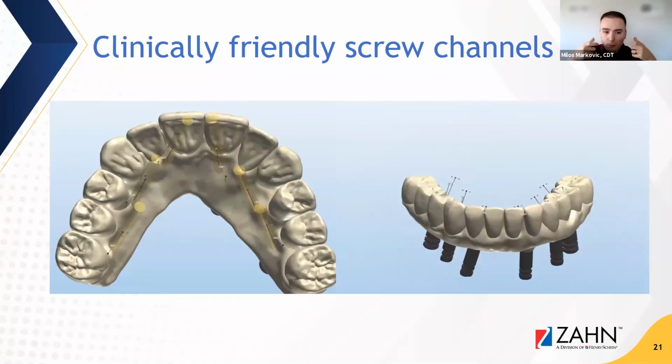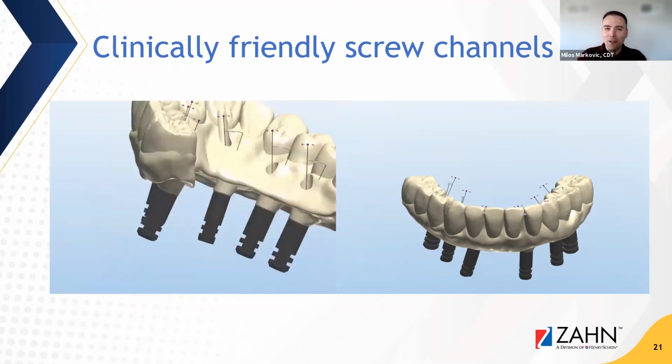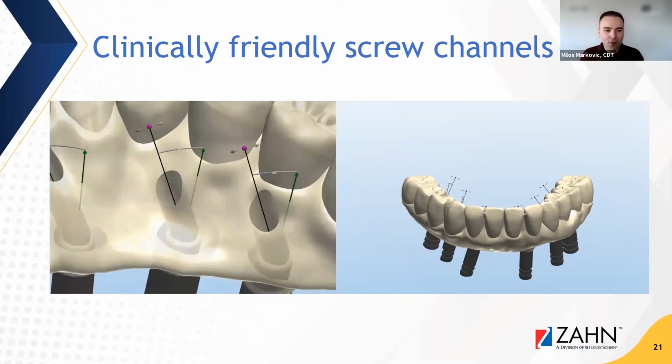And so having the ability to put those channels accessible to the clinician, it really helps you as a lab as well to be like, hey, doc, I'm giving you all these fancy screw channels. How about we do some more work? And it's really worked out. I'm kidding, but it's really beneficial.